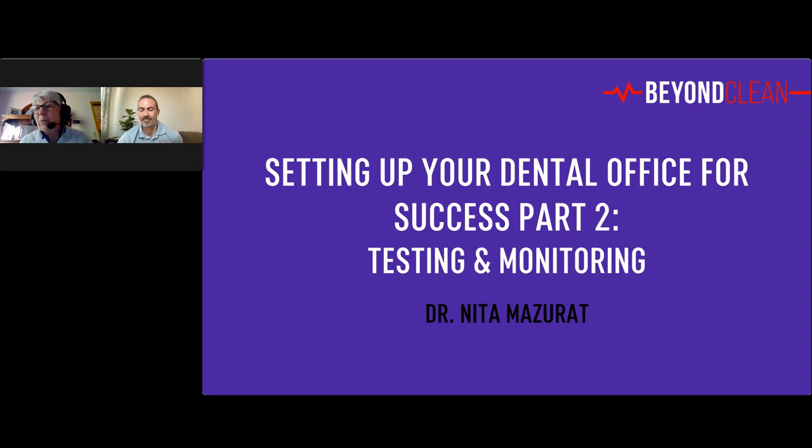This is stuff that we haven't heard about too much in dentistry, called IQ, OQ, PQ: installation qualification, operational qualification, and performance qualification. It's just not something that we ever talk about. There have been some questions here about who's supposed to do this. It's kind of the third question that I was asked, but do you want to start there?